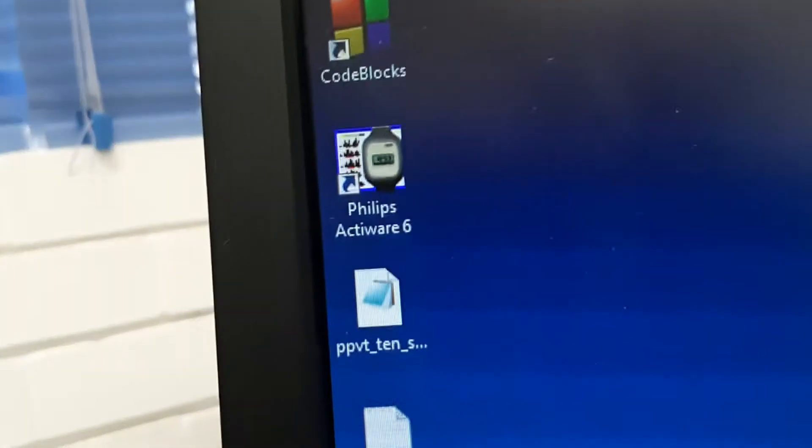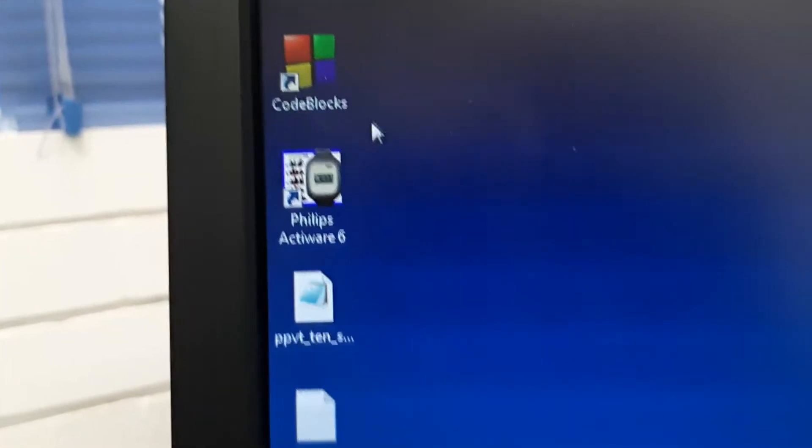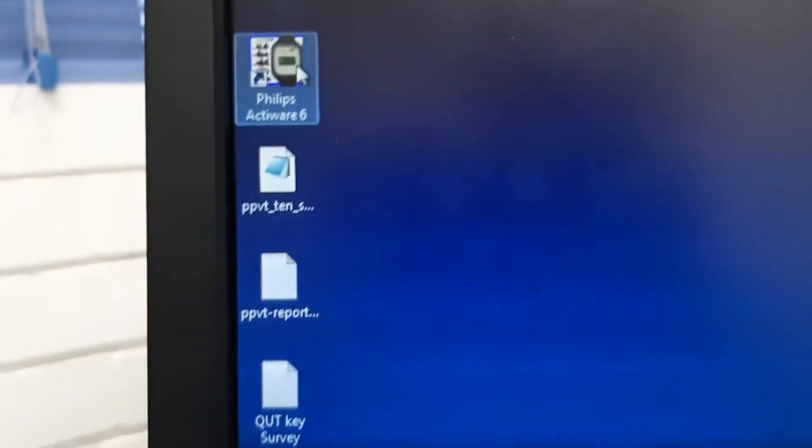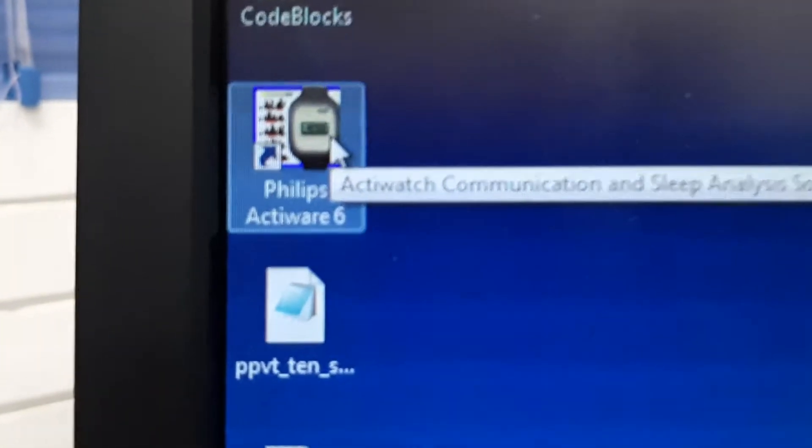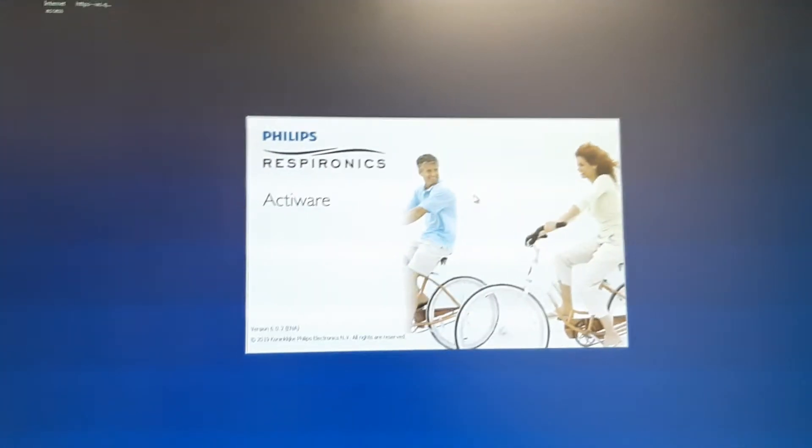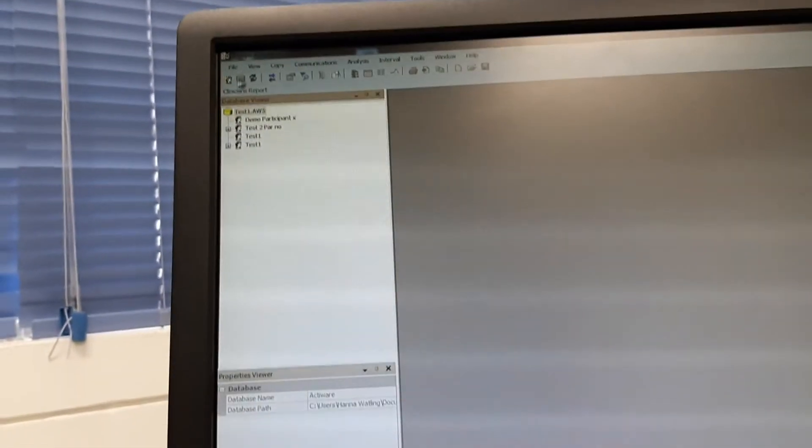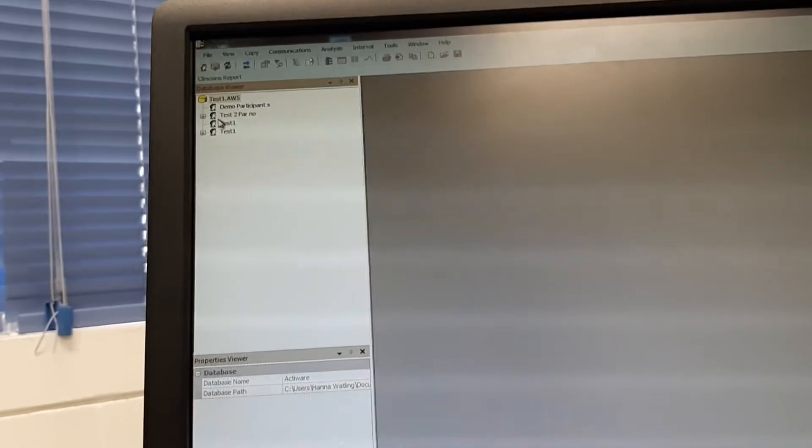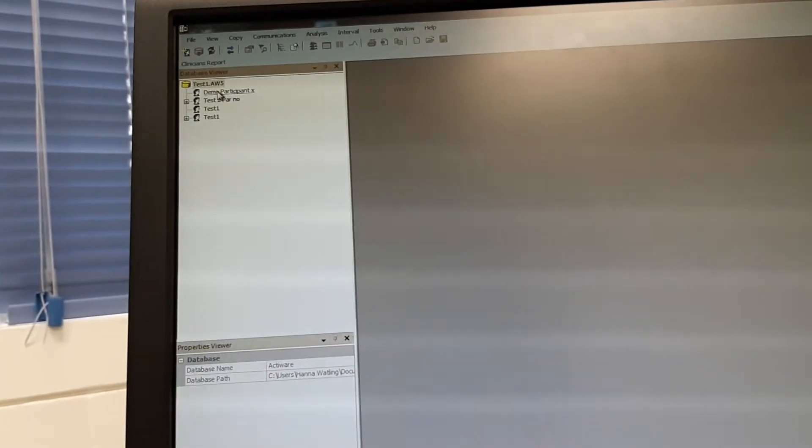Okay, it has been connected and it is charging. The light is looking like this. Now let's check out the data in the computer. I am opening the Philips Actiware software. This is the software and previously I have opened the database named test one. The database is over there and this is the demo participant X data.